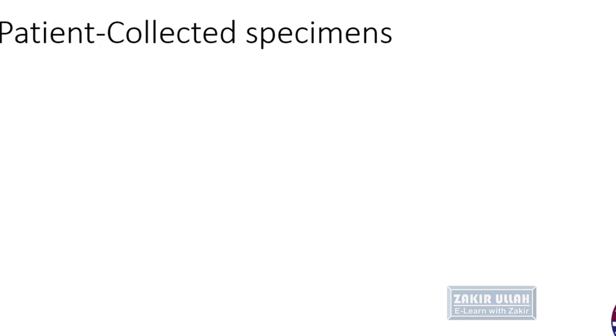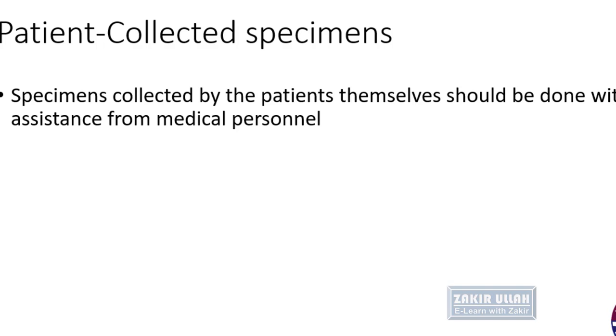Coming to the patient collected specimen. Specimens collected by the patients themselves should be done with assistance from the medical personnel. A person who is the front desk officer of the lab, or who is available for the guidance of the patient, should guide the patient on how to collect different types of specimens.